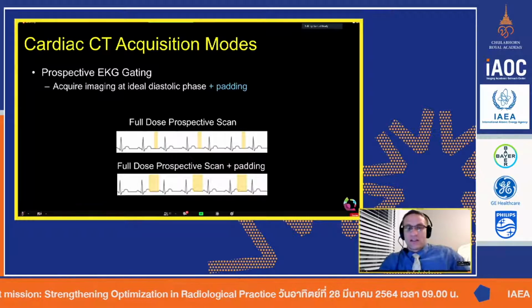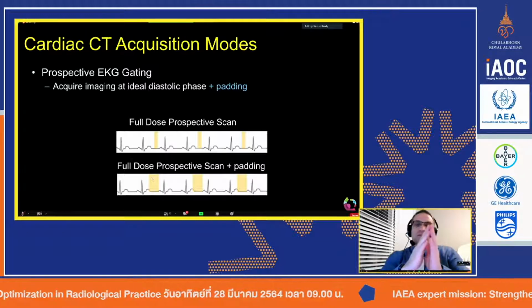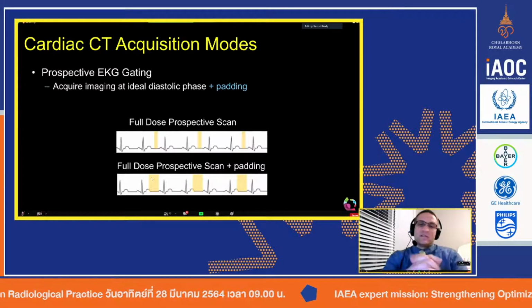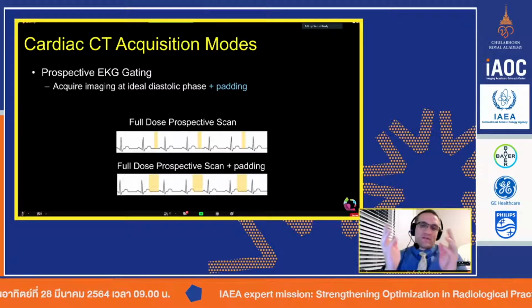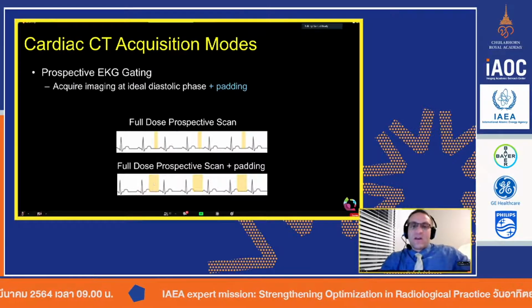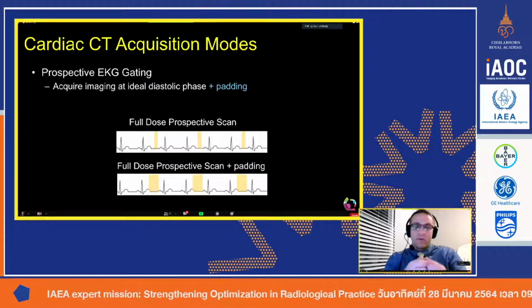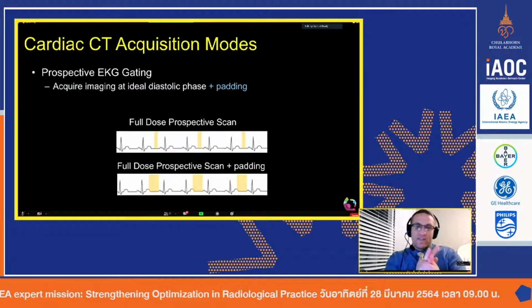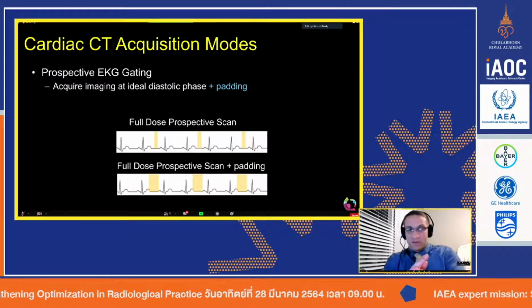We're going to increase it a little bit. So instead of exactly at, say, 45, maybe we'll do 40 to 50 or 35 to 50, so that we have the opportunity to collect that data. And if we reconstruct at 35 and it's still a little too much motion, 40 still a little motion, 45 is good, then okay, we got it.